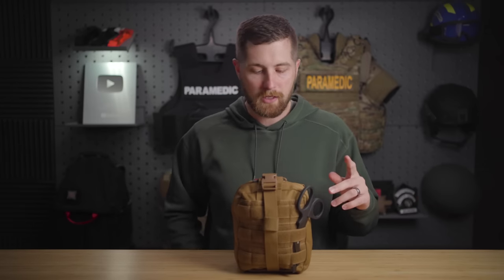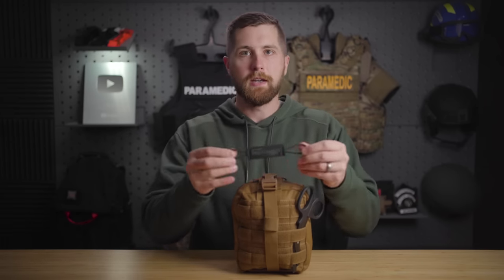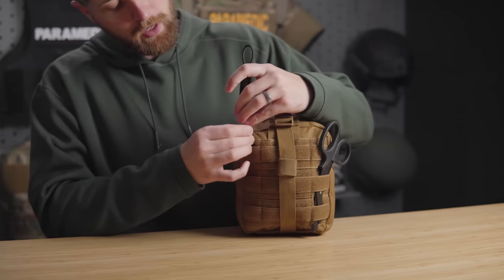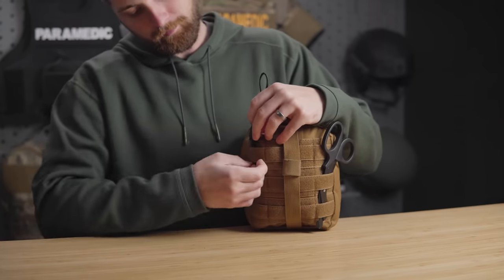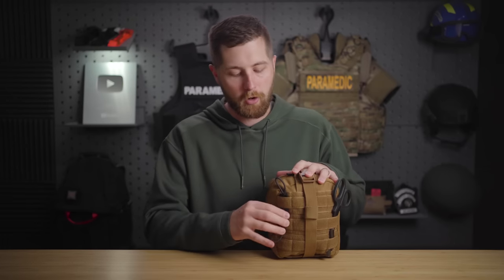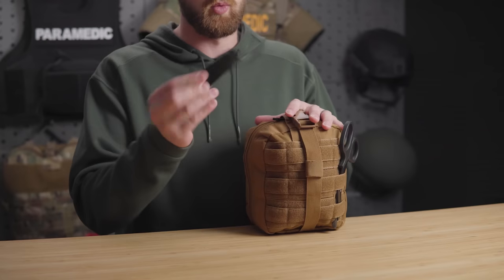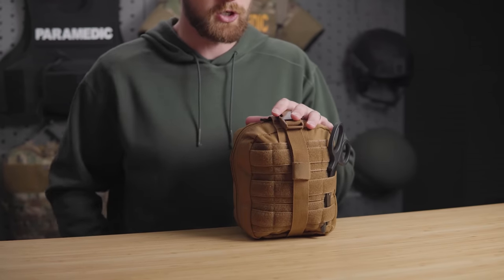One thing they sell that you can mount to the outside is the billy bands. These are just a super simple product — you slip it through two MOLLE loops and you can basically hold a tourniquet on the outside. It won't protect the tourniquet at all, but it holds it pretty well. Any style tourniquet can go in here, whether that's a CAT, a SOF-T Wide, you name it. Kind of a neat product, not the first of its kind, but I really like this tourniquet securing device.